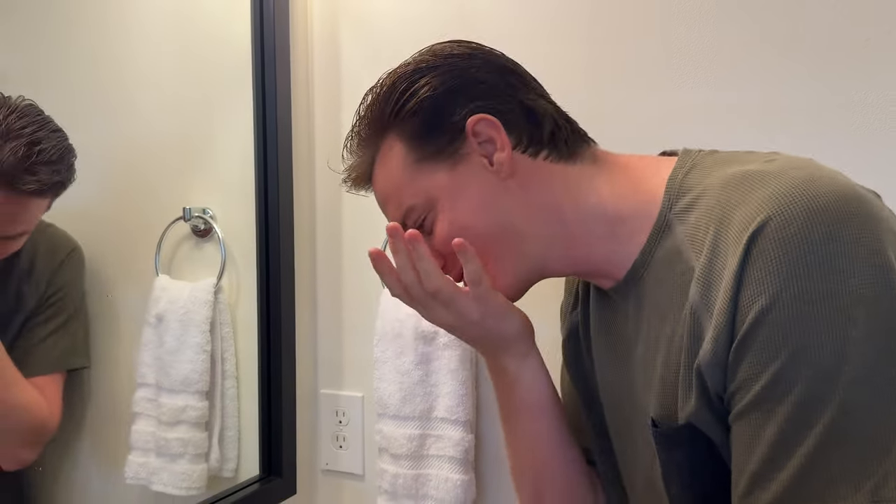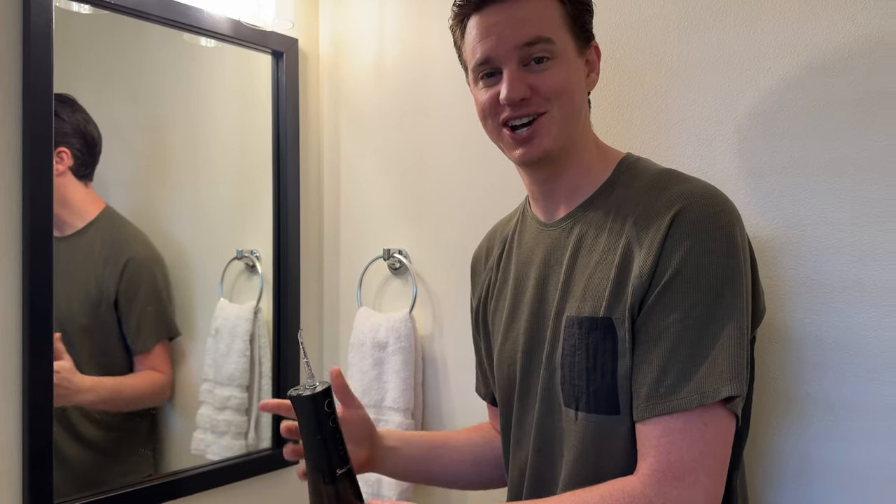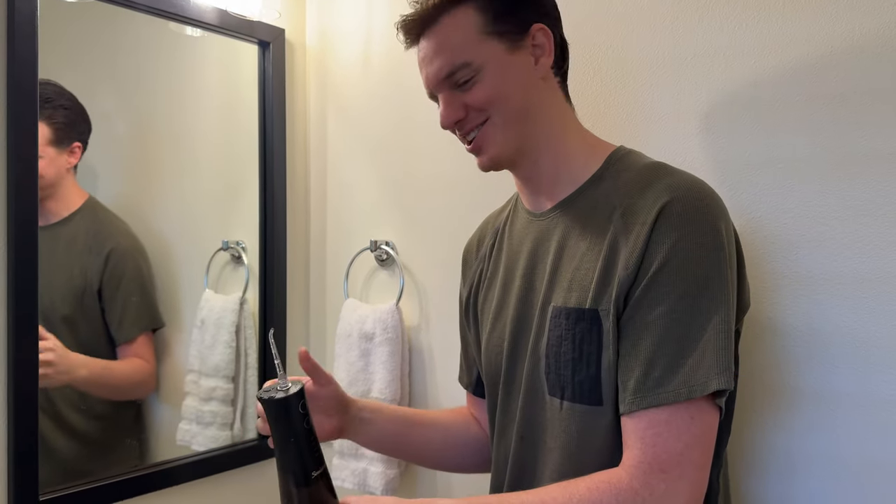Obviously you want to do it over a sink. It's really hard to film and show you how to do this, but that's basically it. I've actually used these for years and they work really well, so I highly suggest checking this out if you're looking to get one.